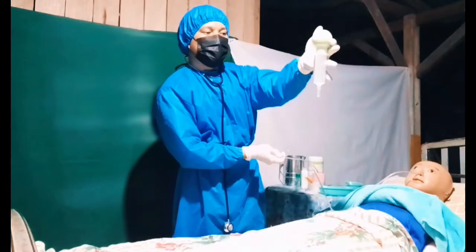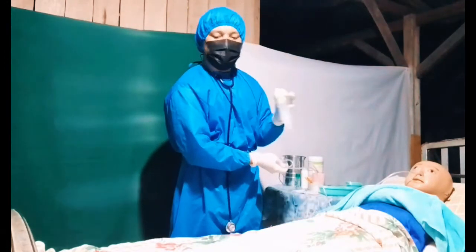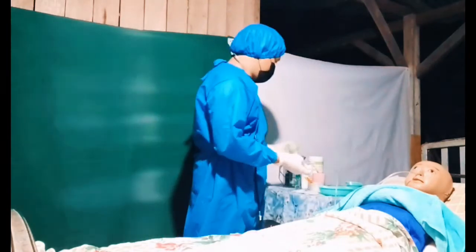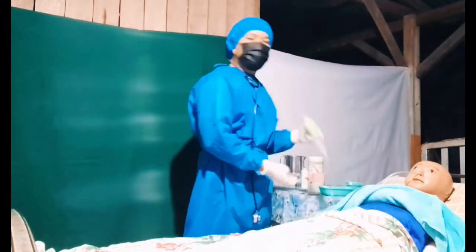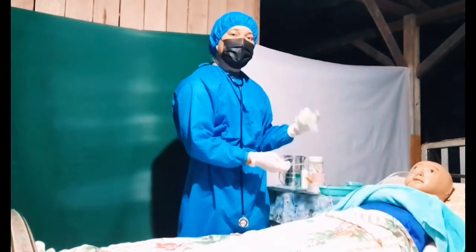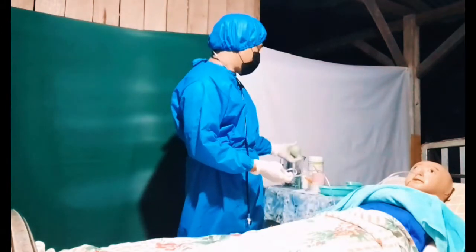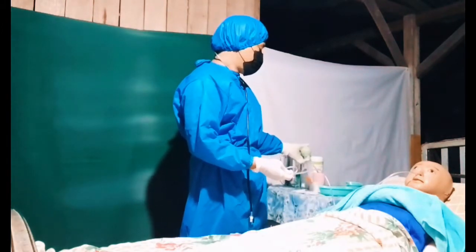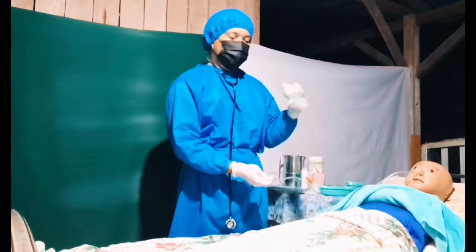Then take some of the gastric content and test it on the litmus paper. Now, the color of the gastric content might be greenish or orangey. And if you put the gastric content on the litmus paper, it will turn red, and that indicates that it is good.